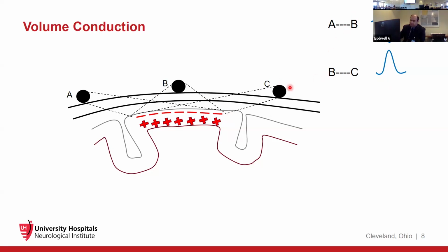So it sounds very simple, but this is the entire basis of EEG. The polarity convention is very important. Depending upon which grid you move the electrode in, that is what's going to determine the polarity of the wave, the deflection of the wave, and the polarity of the electrode generator. So something important to remember.